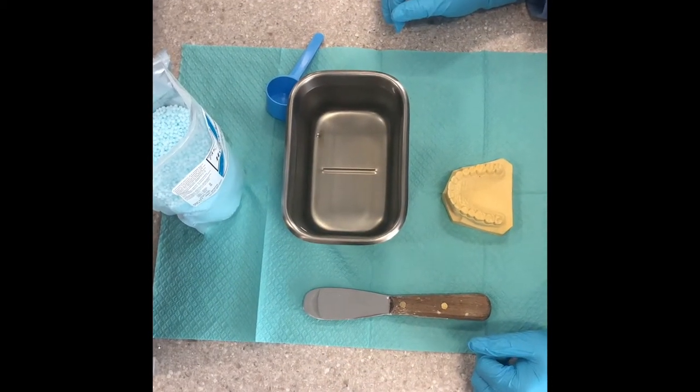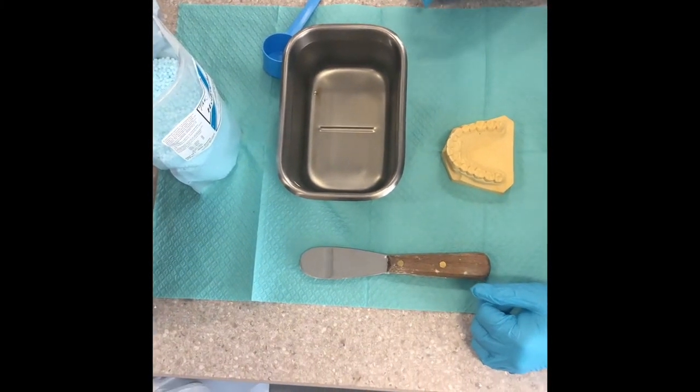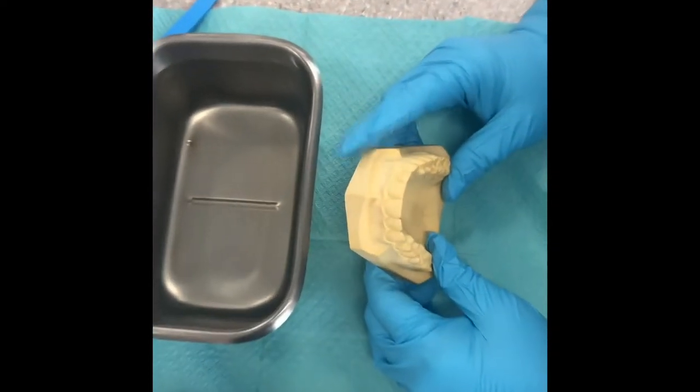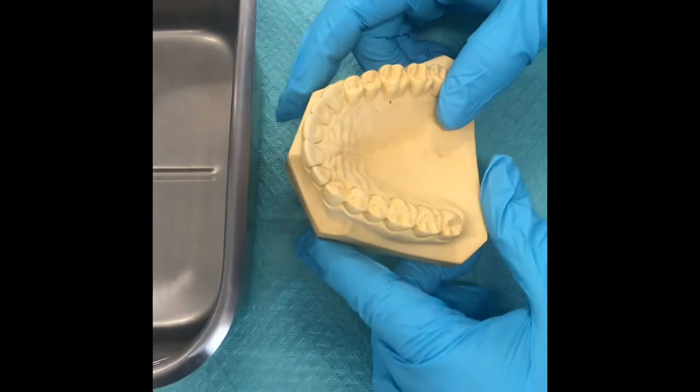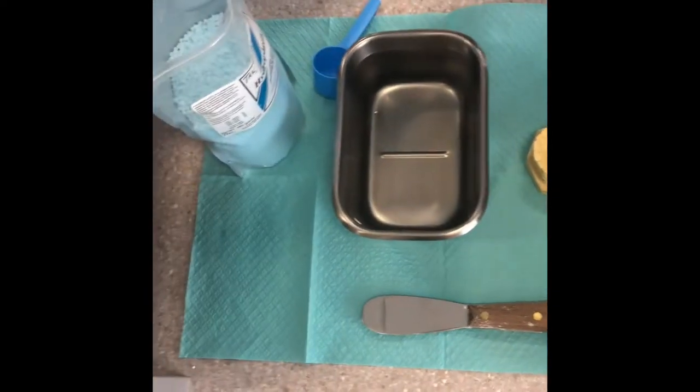We're going to go through the process of how to make a custom tray. A custom tray is fit just to the model or the patient's mouth — more customized versus the metal or plastic trays we use for alginates. This type of custom tray uses hydroplastic.